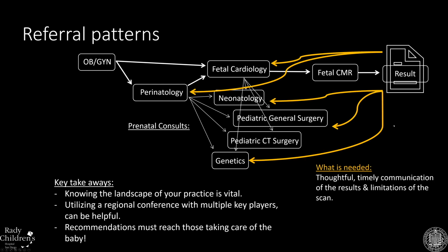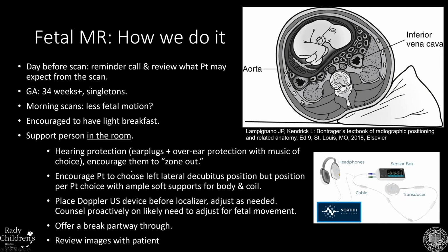And we have to be certain that the results of our scan are communicated back to all team members in a thoughtful, timely fashion. And of course, as programs establish and grow, knowing the landscape of your practice area is vital. Utilizing a care conference is helpful. And, of course, get the recommendations to those taking care of the baby.